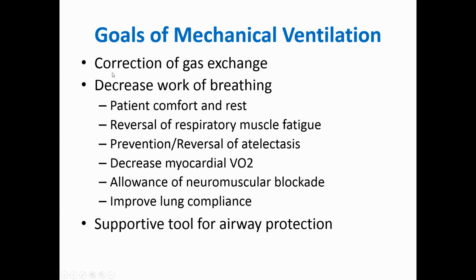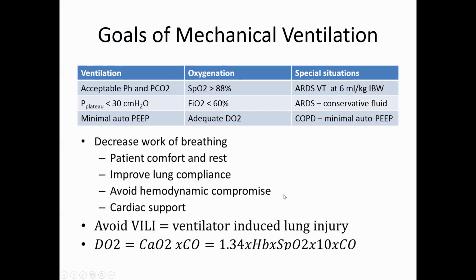Unfortunately, the majority of people focus here. And that's what the residents focus on a lot. What I need you guys to do is focus down here. And that's what you do when you examine patients on ventilators. So if you think about this, in addition to all of these goals, you want to use it in a safe way, avoiding ventilator-induced lung injury.